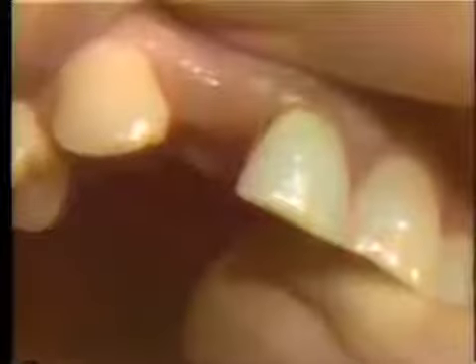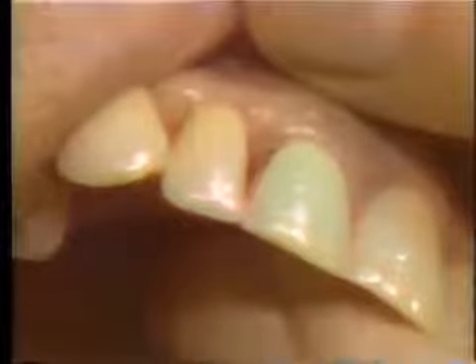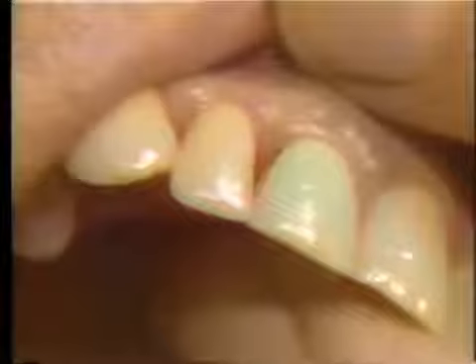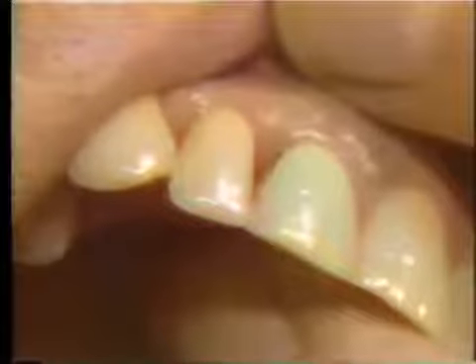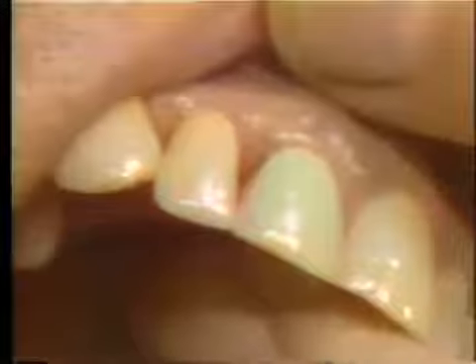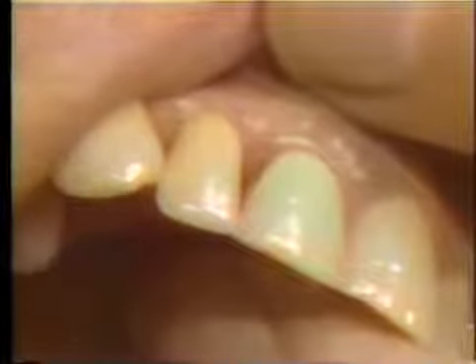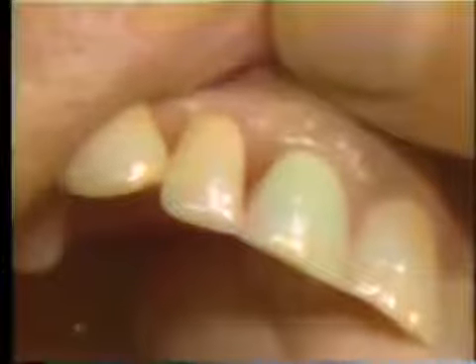And then we'll pop this facing back again in here, and we'll take a look at that second line that we have drawn in there. And I'm not sure whether on the TV camera here you can just exactly see that, but from where I am, it's a sort of happy compromise that would bring the gold far enough forward for self-cleansing and for a good contact point, and yet would not be showing any more gold than is necessary.